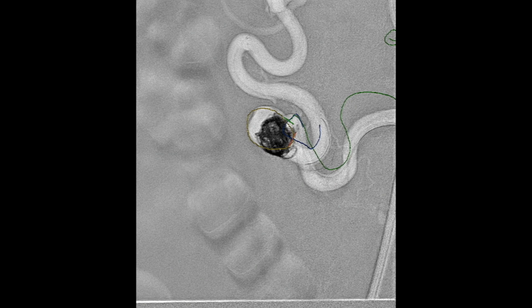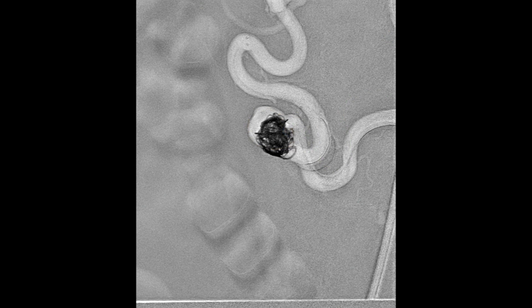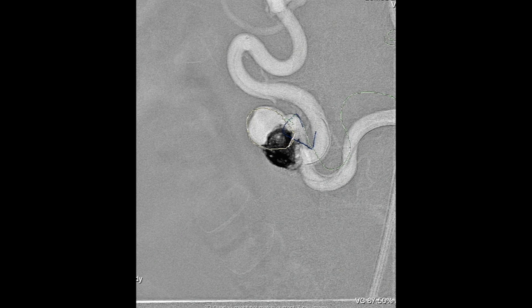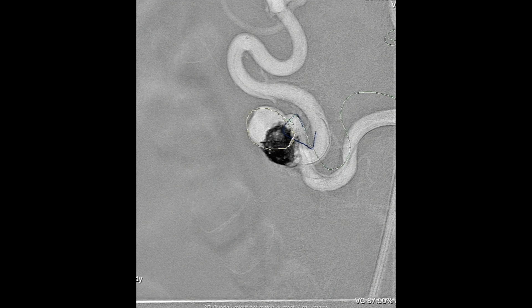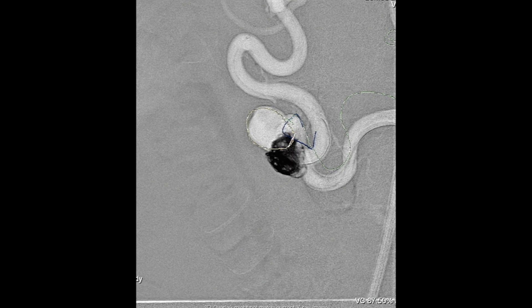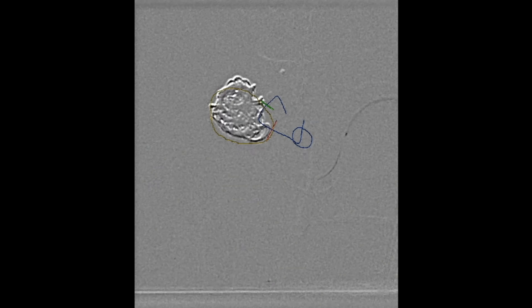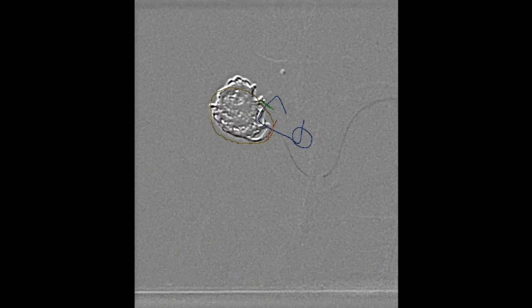You can see the significant respiratory motion that occurs. In fact, a lot of the time when we were deploying these coils, we had the anesthesiologist hold the breathing in the same phase as when we shot the arteriogram — full inspiration or full expiration — so that you get alignment of the coil pack with the background angiogram. Using subtraction, you can see more coils being placed in preparation to place a stent.